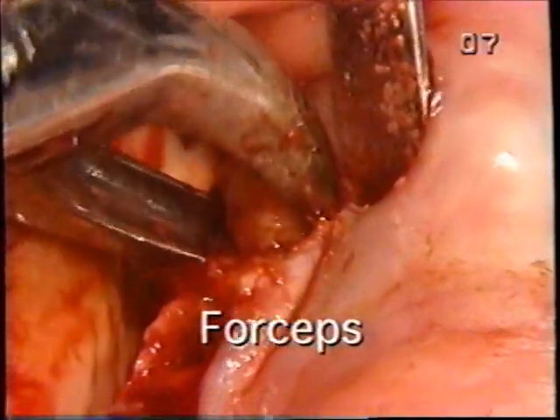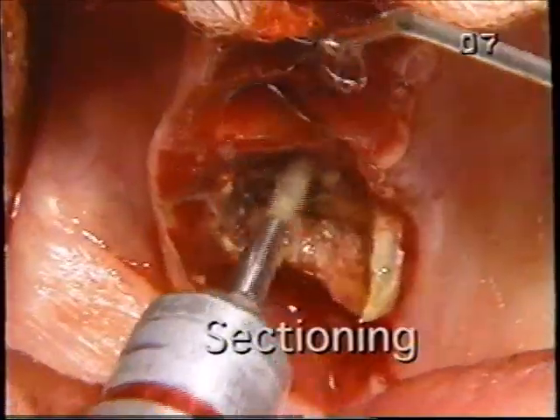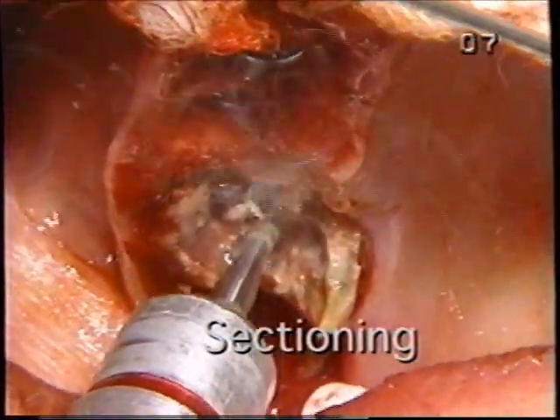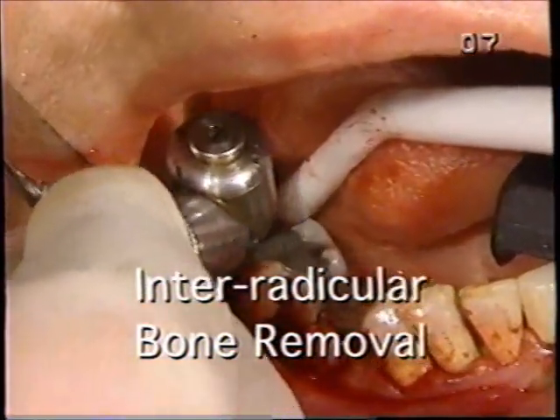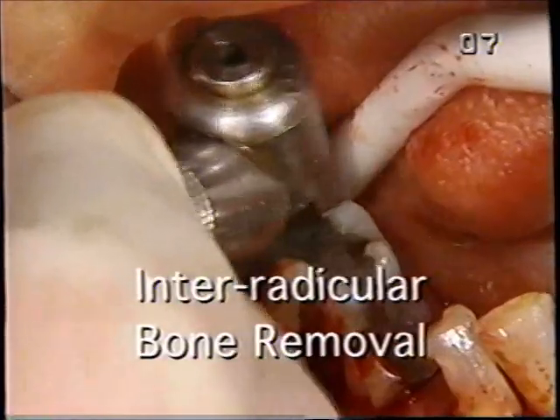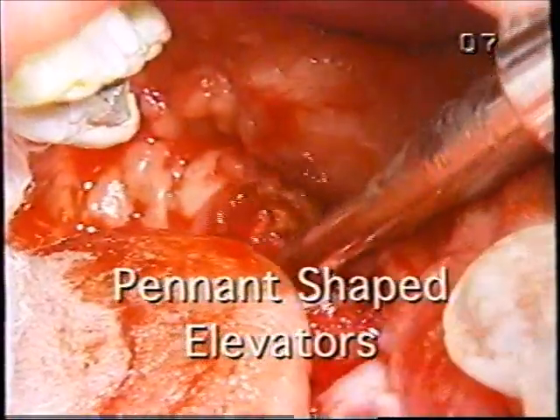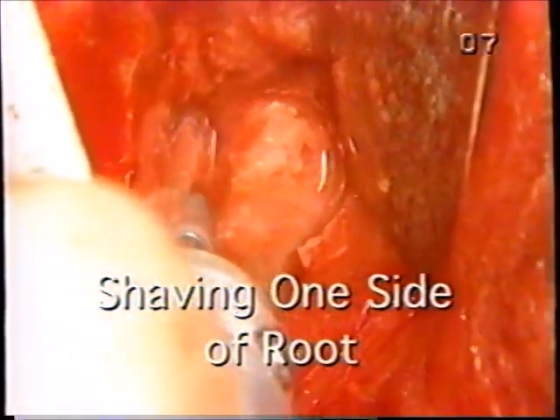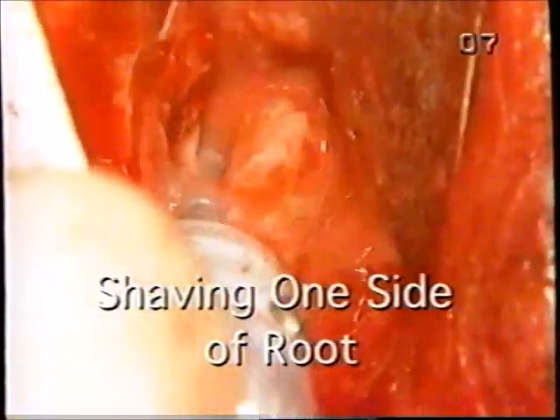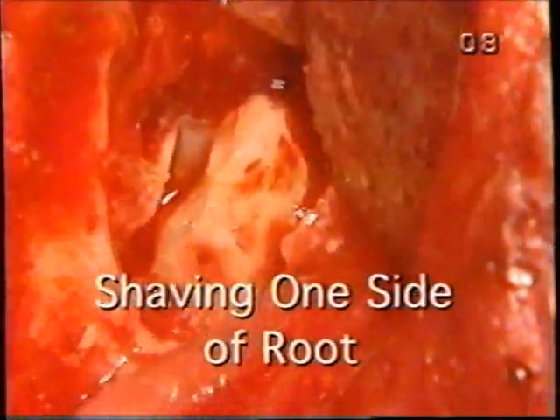The forceps is another excellent tool for root removal. Section cuts, followed by tooth fracture. Using purchase points for elevators. Inter-radicular bone removal, removing bone between the roots in order to be able to place an elevator, particularly in molar areas. Pennant-shaped or curved elevators. Shaving down one side of the root, we can actually remove some of the tooth rather than the bone, conserve some of the bone, and have a less traumatic procedure for the patient.